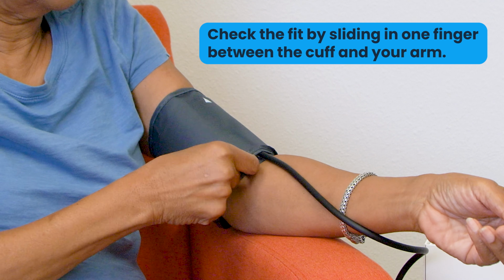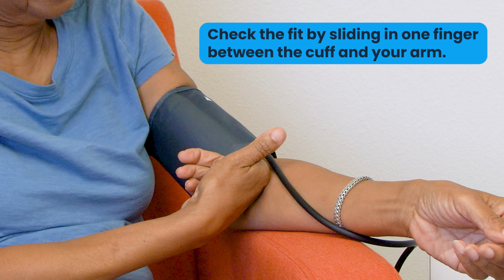The cuff should not be too tight. You should be able to fit one finger between the cuff and your arm.